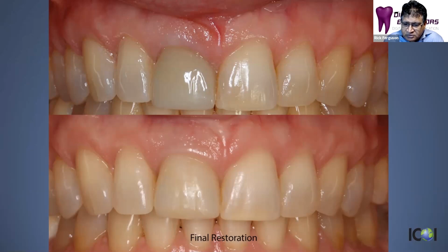Okay. So that's how we're using in-office surgical guides, not just for full arch cases, but for single tooth cases as well. And as a matter of fact, about 95% of the cases that we do in our practice now are being done with surgical guides, because we have the ability to fabricate and use surgical guides for almost every type of case that we've encountered.